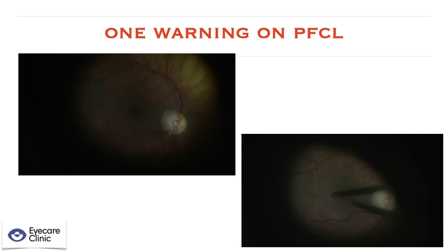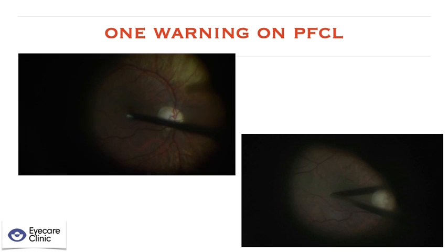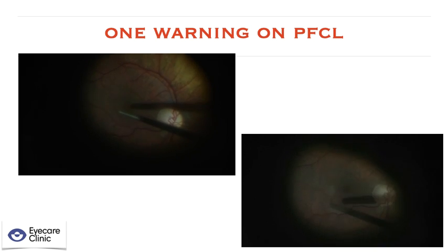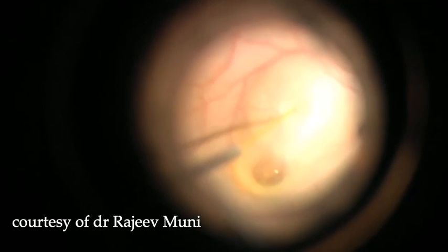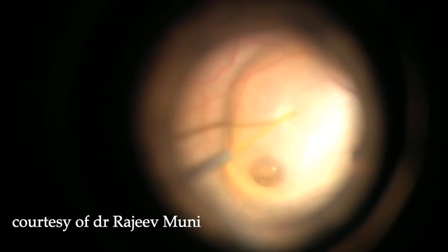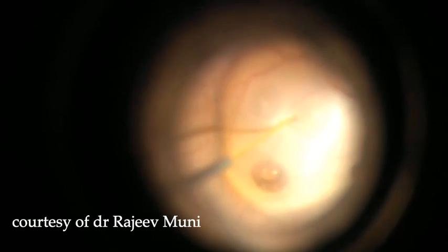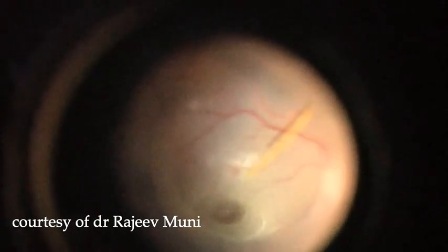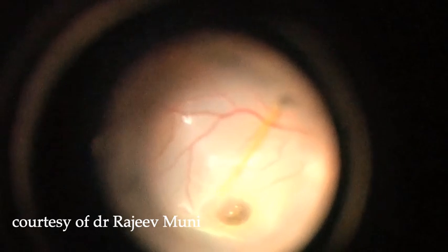So how to solve the problem? We have different options. If it is not subfoveal, we can directly aspirate the PFCL bubble with the Charles needle. But if it is in the fovea, like in this case, kindly provided by Dr. Muni, we have to detach the retina and try to aspirate the PFCL, in this case with a 41 gauge needle.